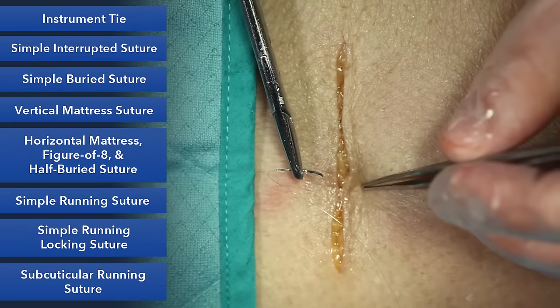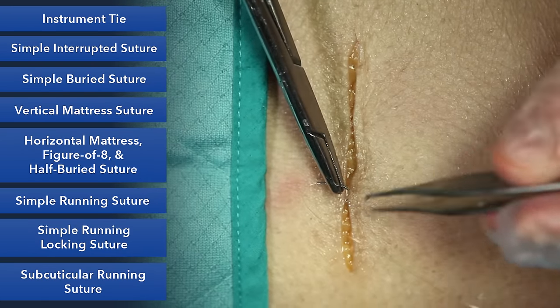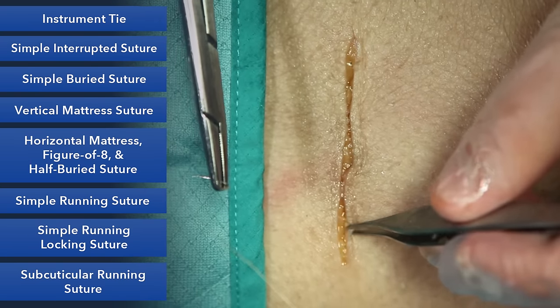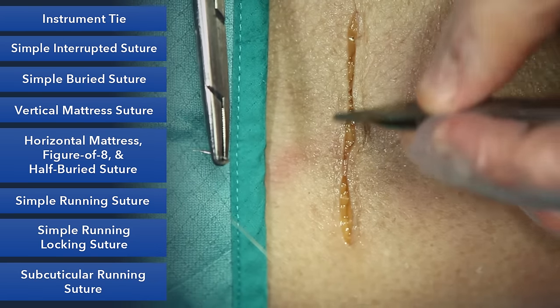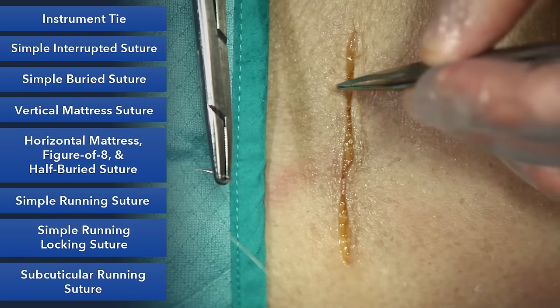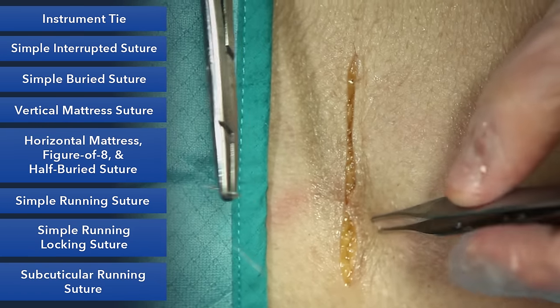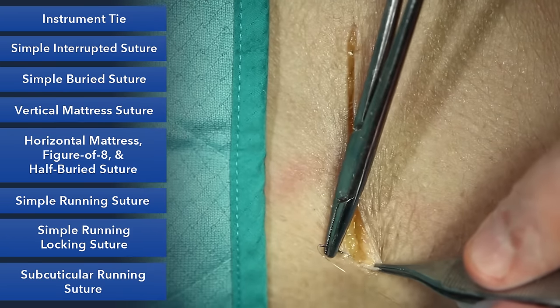Our next stitch is a running subcuticular suture. Out of all the sutures we're teaching you, this is probably the hardest to master. This is probably for the most cosmetic closure, as they're running within the dermis deeply, so there's no sutures on the outside at all. So you won't see any of the railroad tracking that you would see from any of the other outside sutures. This is an absorbable suture, and we will start by burying the knot.